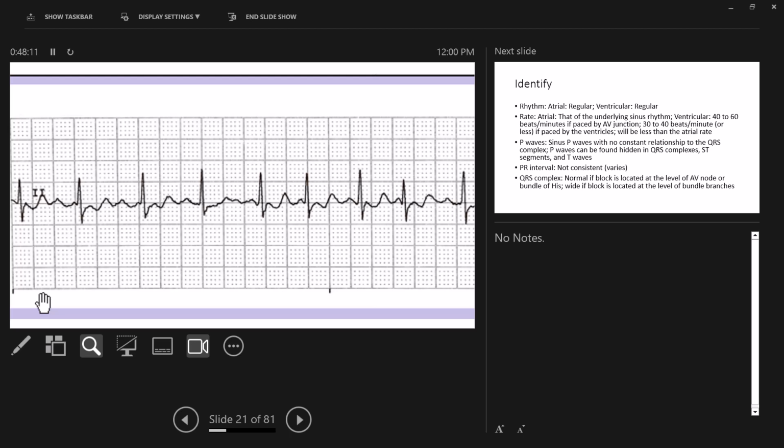Yes? It looks more like atrial flutter than MAT. With atrial flutter, you will see sawtooth waves that are consistent, because atrial flutter means you have one cell in the atria that is firing consistently, and periodically it will let every second, third, or fourth through, unless we have variable conduction, in which situation those F waves, those flutter waves, are going to be consistent.